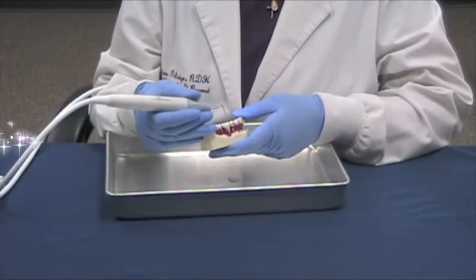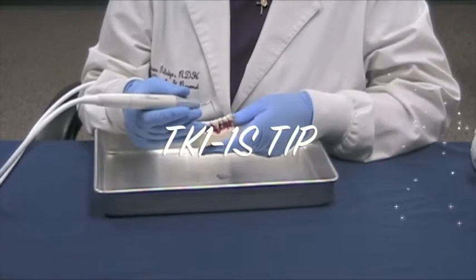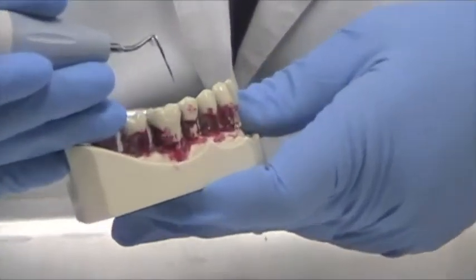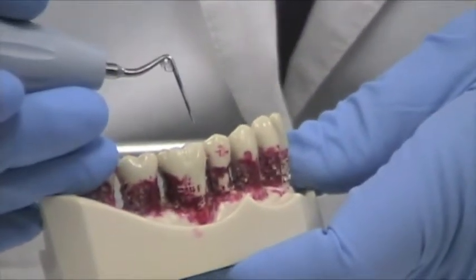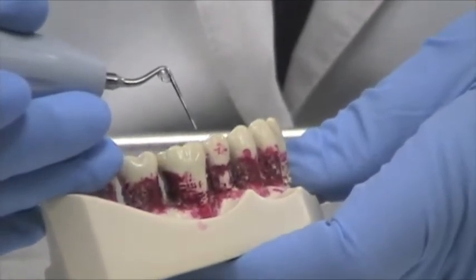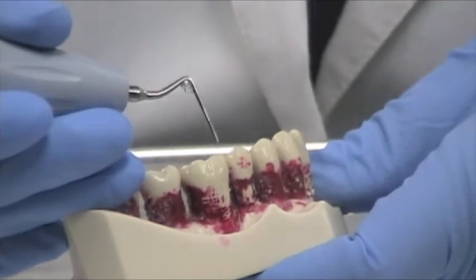We're first going to start out with demonstrating our TK-1-1S tip. I like to call this my short perioprobe. And for all you hygienists out there, you can see why I call it that because it looks like an exact perioprobe. The demarcations are 3, 6, 9, and 12.